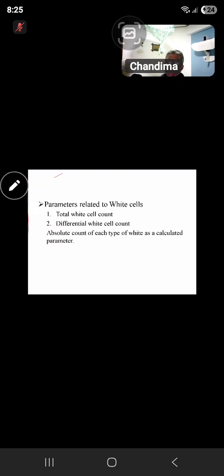So these are the situations where the machine gives us the flags, right? So at that time, what do we have to do? Before we go to that, any problem regarding the WBC parameters?